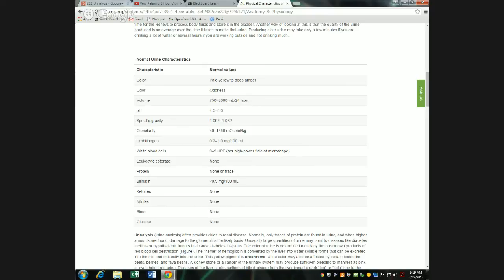If you happen to grab a tube that doesn't have anything printed on it, like this one, then make sure that your tube is filled up the same as mine. They match the height of this. Now this tube I happen to grab actually has a little Sharpie mark on it. Somebody put it there at the 12 milliliter mark. So you might see that, but I've also seen some here that are marked at the 10 milliliter mark.